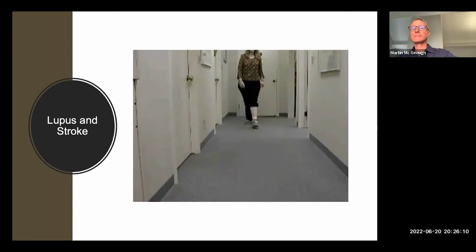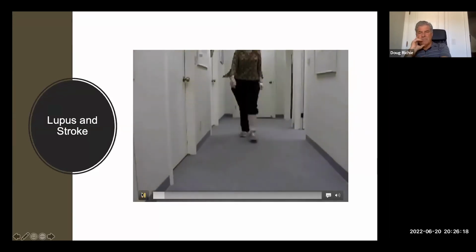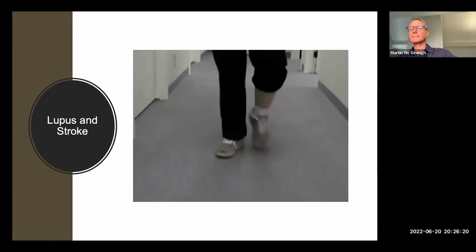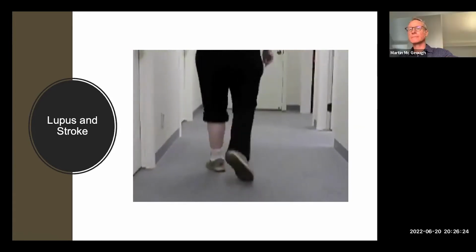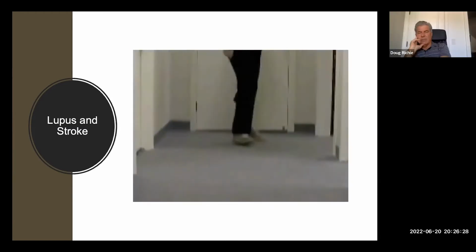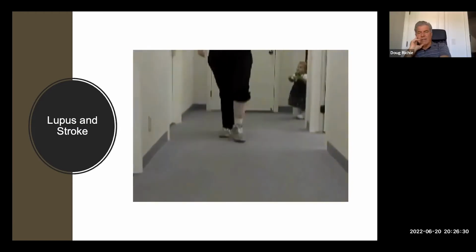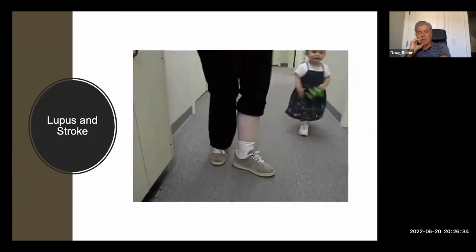She's 26 years old. Watch her left foot and notice her left arm. She has a left side hemiplegia. Again, not severe, but she's forefoot striking on the left. She's not heel striking. She trips and falls. Her doctor prescribed a solid AFO, which she hates to wear. She's 26 years old, and she's a mom. That's her young daughter there.